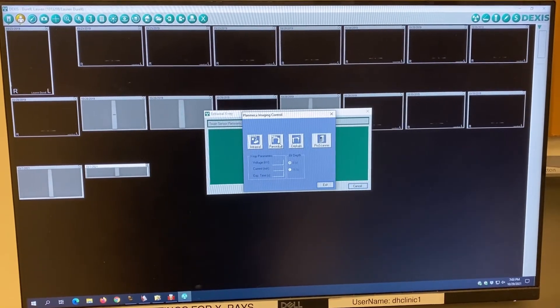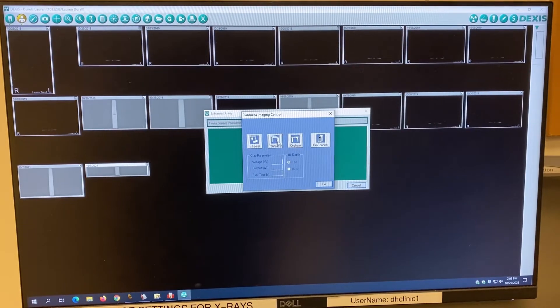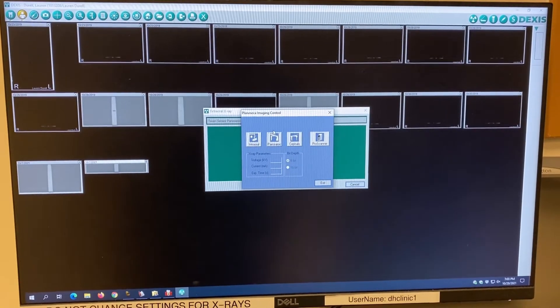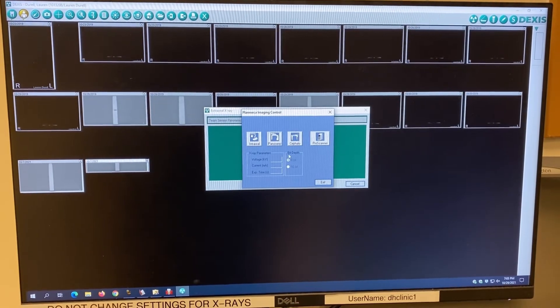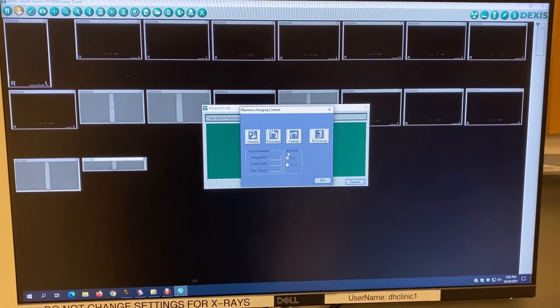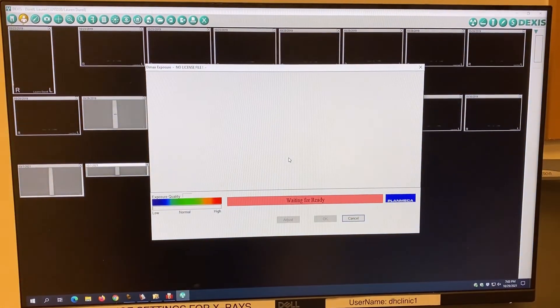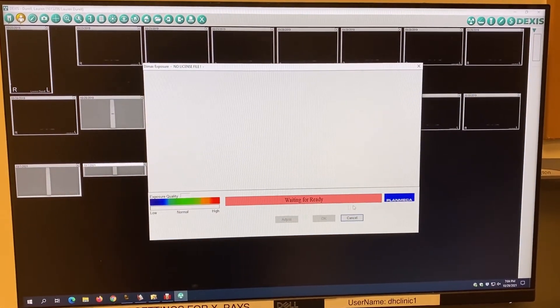Press on the panoramic key once and wait for the small dotted line to appear around the key. Once you have this screen waiting for ready, you are ready to grab your patient and get them placed into the pan machine.